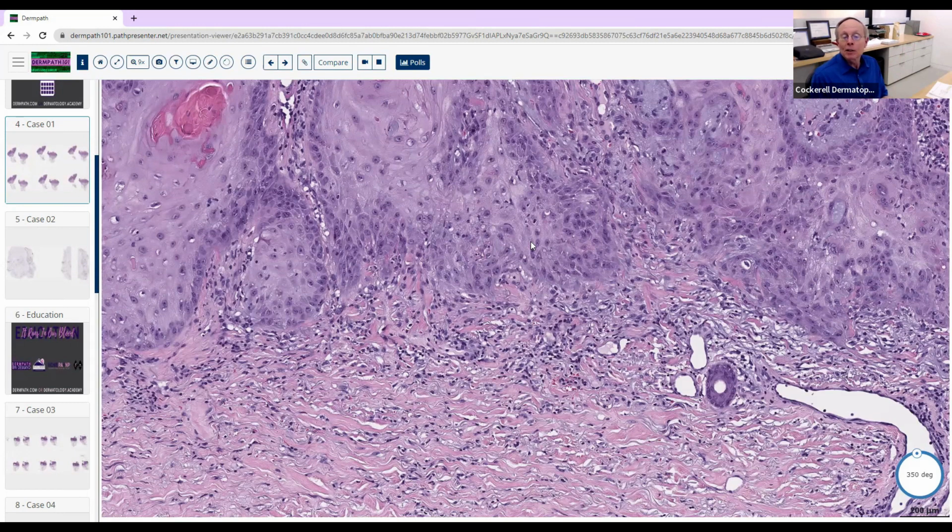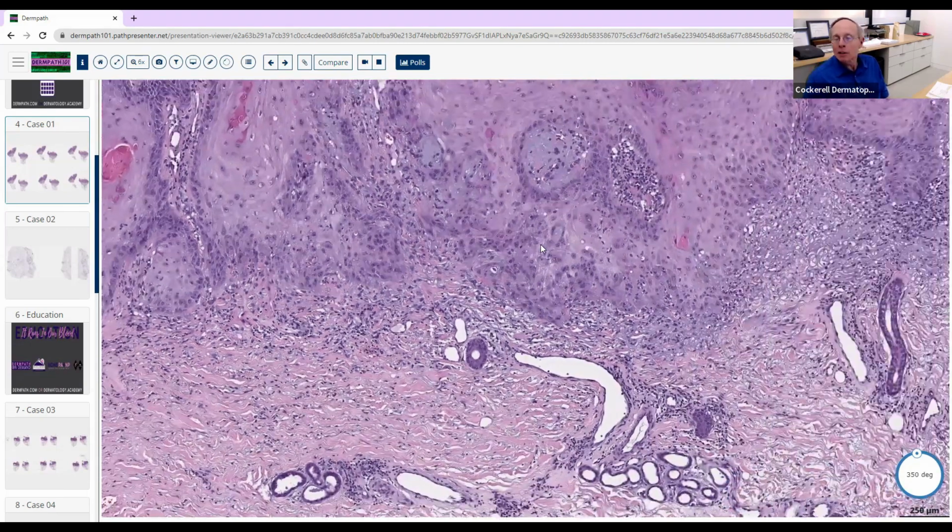So it's a reaction to the underlying organism. It's another way that the host tries to deal with those sorts of things. Sometimes foreign bodies also, like somebody that maybe had an auto accident and got glass in their skin. They get a secondary granulomatous inflammation and pseudocarcinomatous hyperplasia overlying that. But this one's more subtle here. You don't see any of those things.